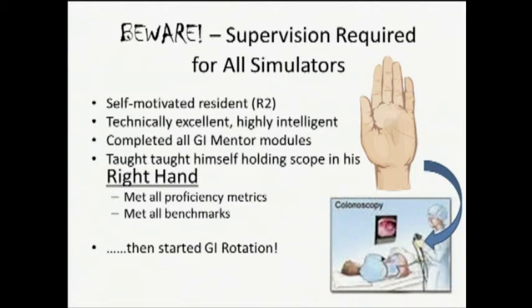And I want to tell you a little story to highlight that supervision is very much required for all simulators, not only endoscopy. When we got our GI Mentor simulator a year or two ago, we had a very self-motivated R2 who was doing his research years.